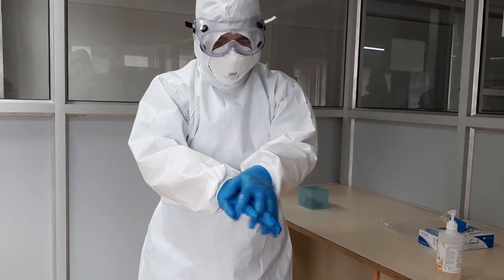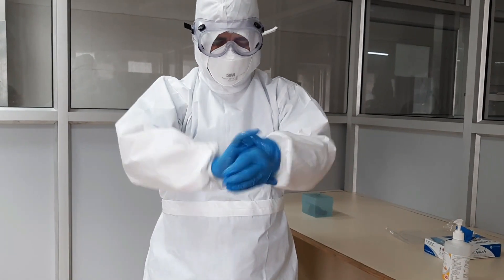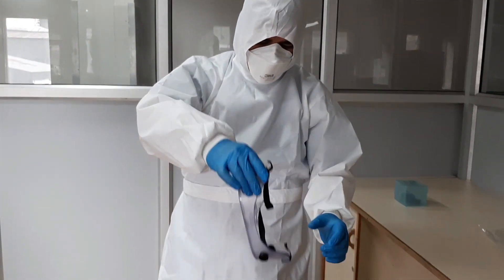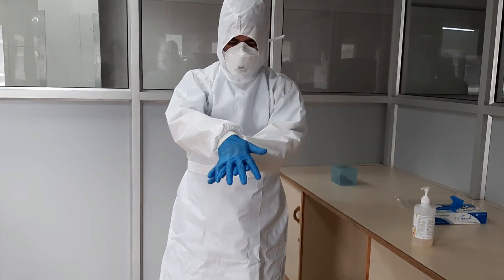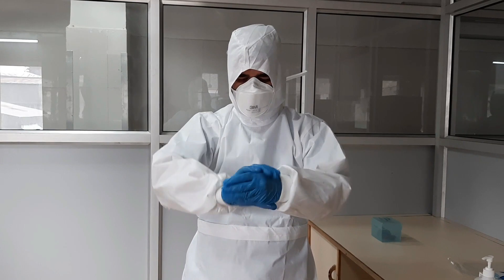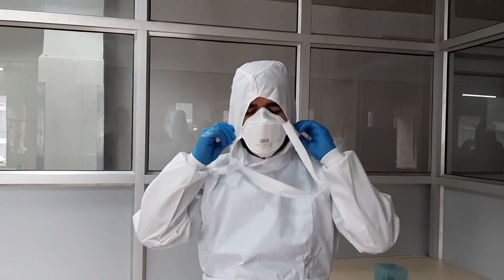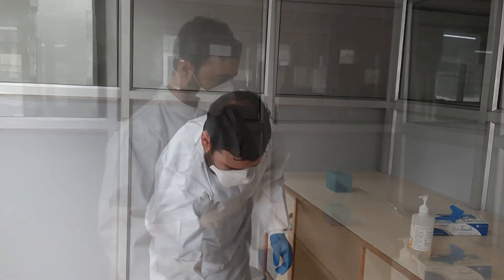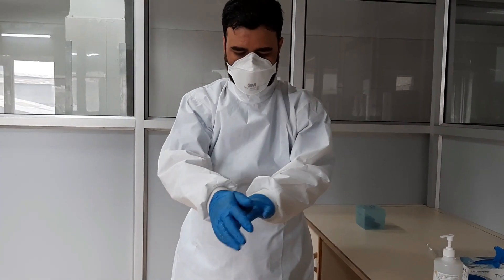Perform hand hygiene. Remove your eye gear or protective glasses first and discard in the color-coded bin. Remove your skull cap or surgical hood by carefully unknotting the bands and discard appropriately. Perform hand hygiene.